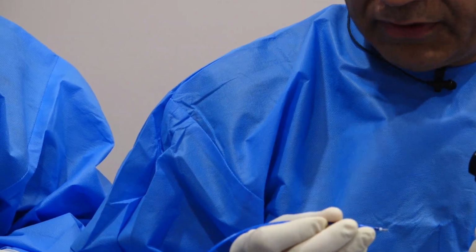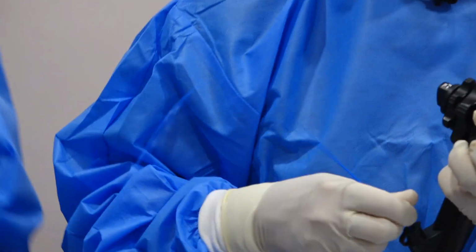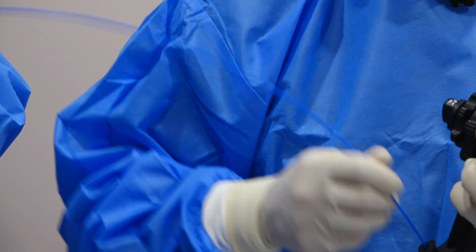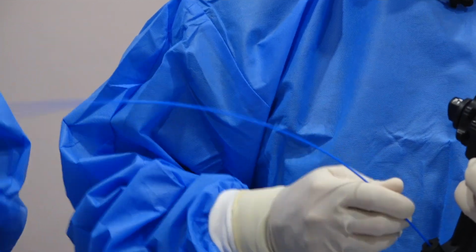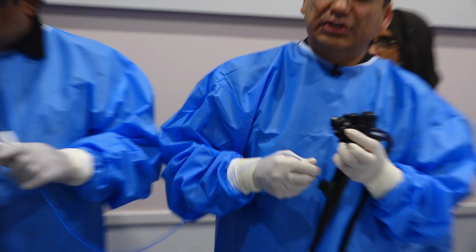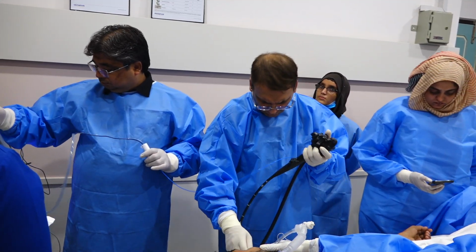And pull the knife back. You don't have to push the whole knife out if you don't want to, but usually it ends up being out completely. So just keep in mind how long that is, because you don't want to cause a trauma.